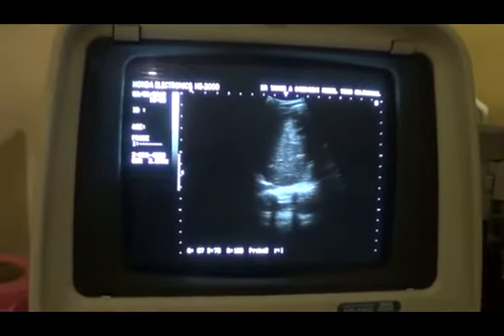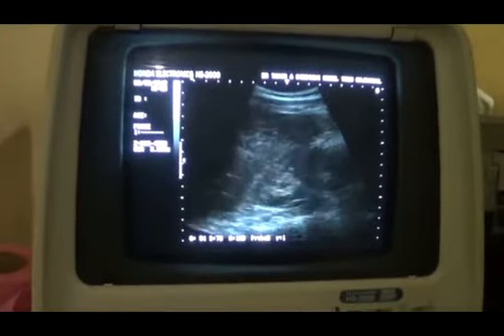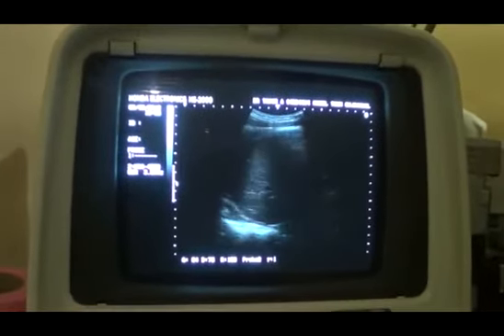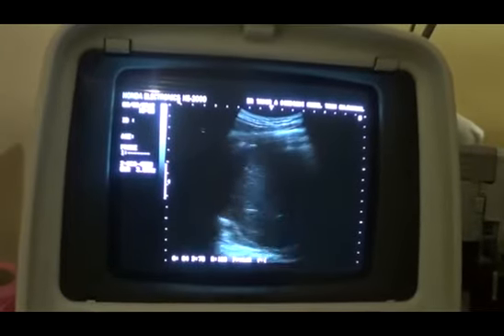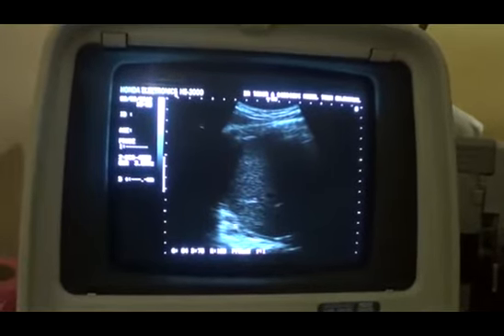Now along with it, we see that the kidney is normal. It does not relate to the kidney, and when we try to see above the diaphragm, we see a small amount of fluid in the pleural space. This is the fluid with lung tissue.